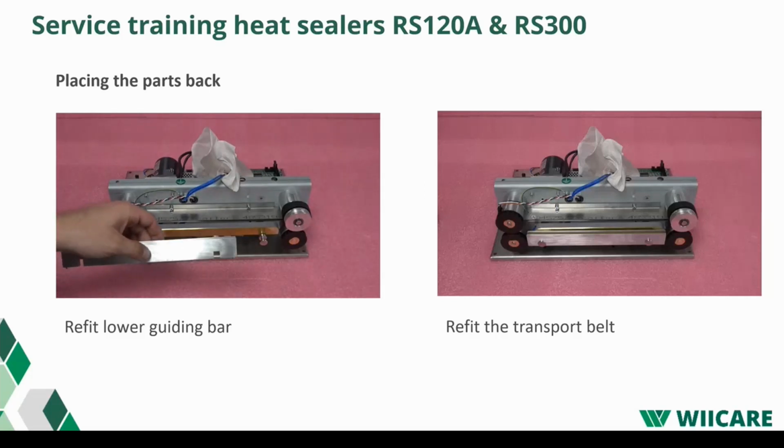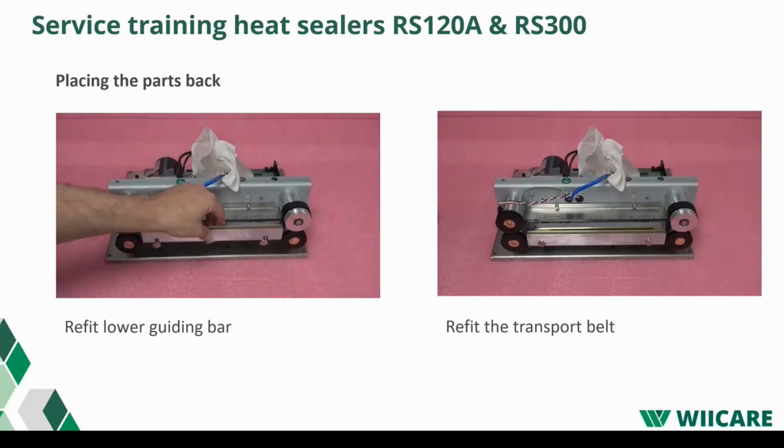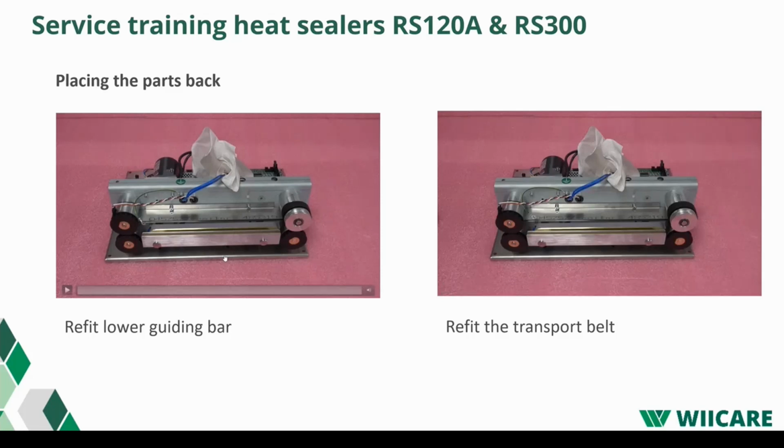Put the lower guiding bar back in its place. Note that the right side is slightly longer. And what you also have to notice with these guiding bars, the lower guiding bars do not have as deep a slot as the upper ones when you reinstall them. Pull the transport belts back on. If the belts are worn out or damaged, replace them with new ones.